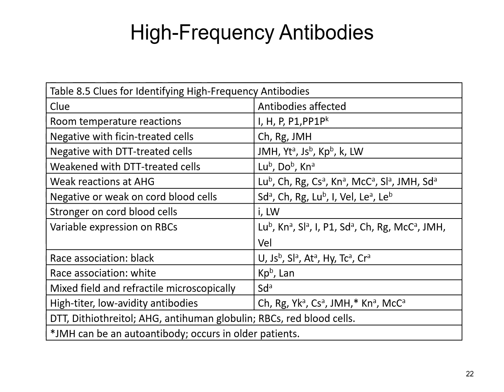So here you do have a chart that lists those high frequency antigens. Again, a lot of these you will never see. Occasionally you might have a patient that will come in that will have one of these. If you work at any of these blood centers like Red Cross or anything like that, then you will become more familiar with these. But at the MLT level, basically what you need to comprehend and understand is that these can be present. More than likely, if you experience something like this, it's going to get sent to a reference lab, unless you are at that reference lab, and then you're going to have to learn a little bit more about these.